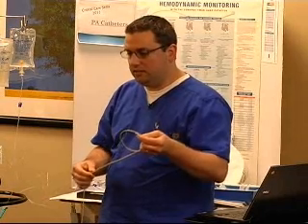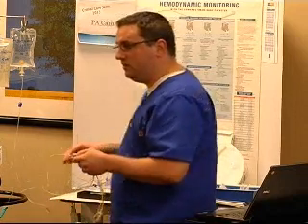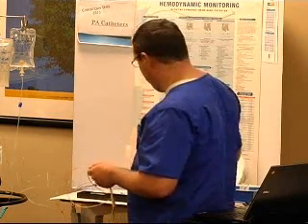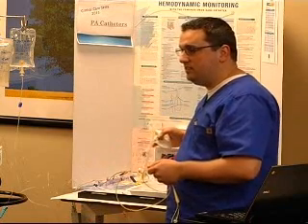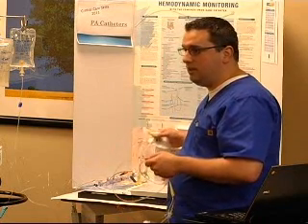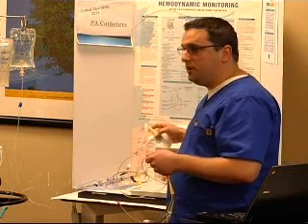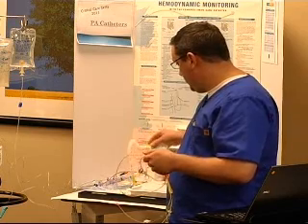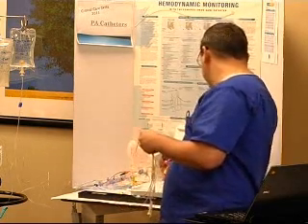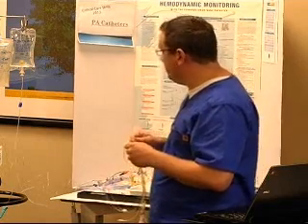Other than that, the main thing with pulling the catheter is, if you're going to keep the line, you always want to make sure that it's acceptable and ready for reinsertion should you need to put another PA catheter in. Making sure it's nice and clean. Sometimes they get a little bit dirty. You can clean that off with ChloraPrep or a swab, and then put your obturator cap on. Okay? So, other than that, for discontinuing it, I can't think of anything else, so that's it.